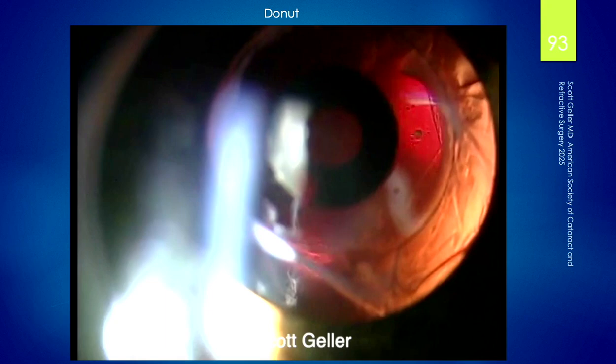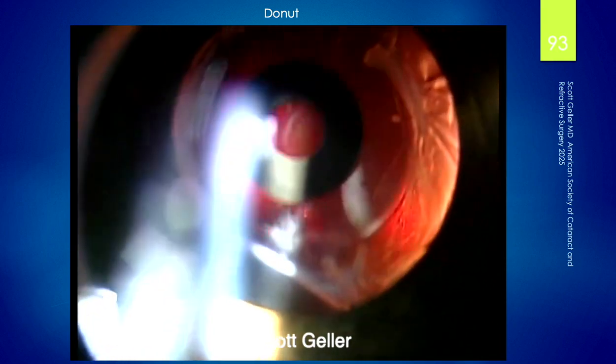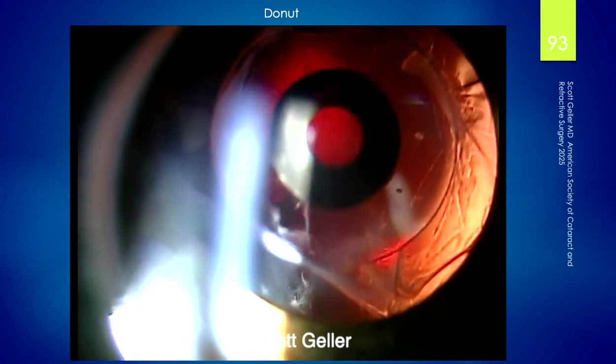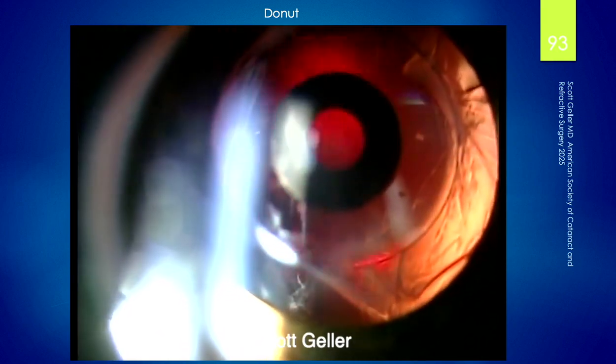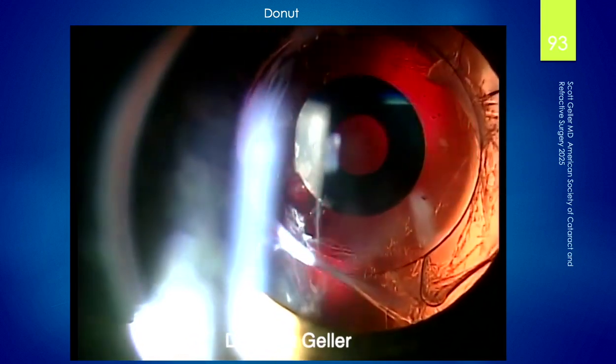They did a capsulotomy on him. And after the capsulotomy, he was extremely bothered by a capsular tag, let's start this again, right behind the implant. And you can just see it right there. There's a little string hanging down there. This was extremely difficult to get.